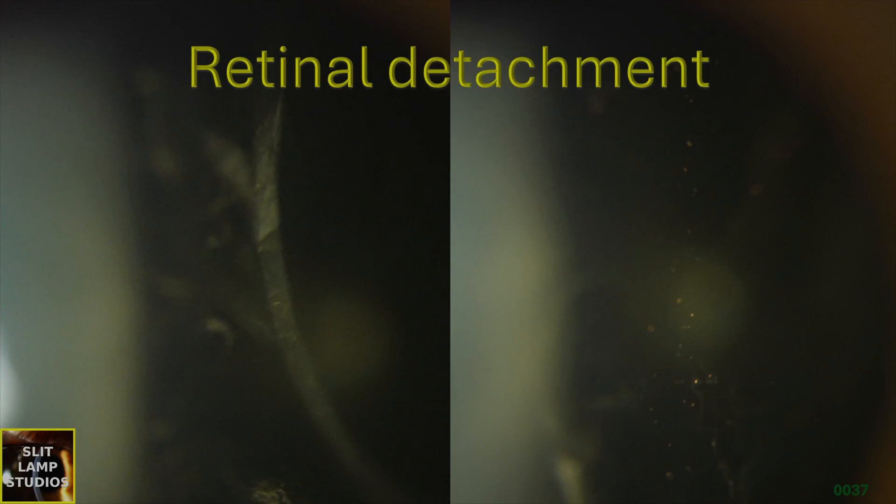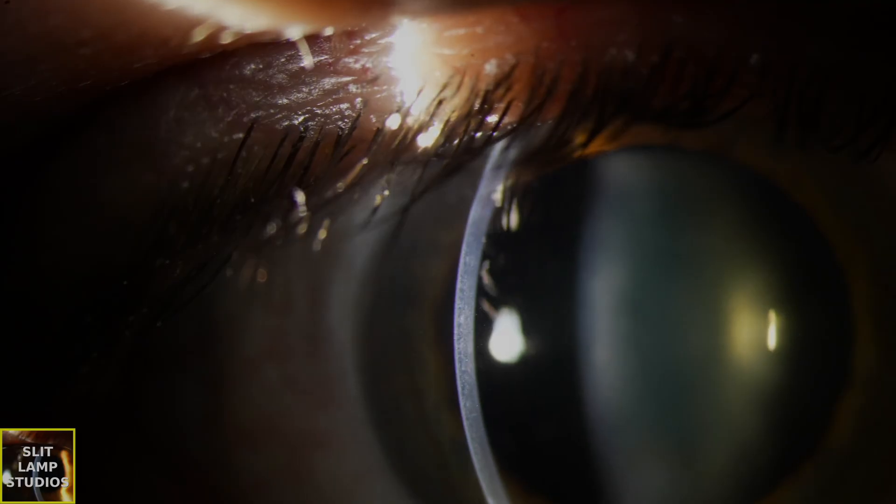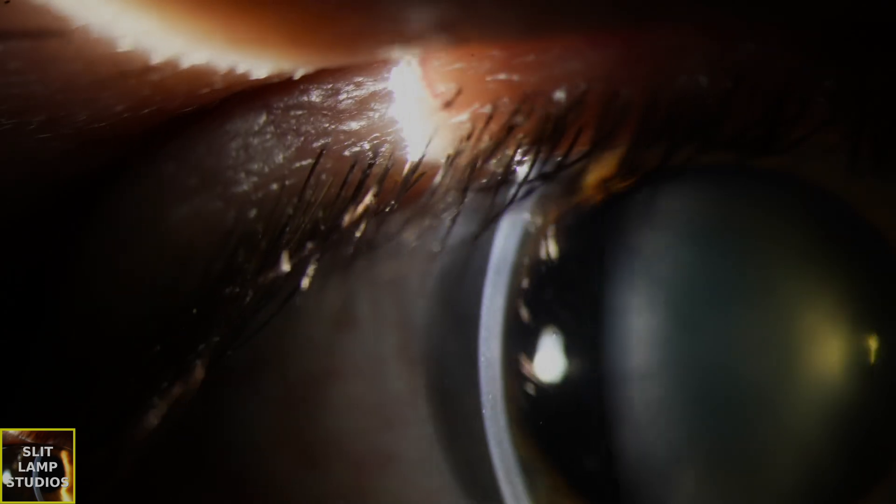Retinal detachment. In this case, we have a patient who presented with a two-day history of flashing lights and floaters. Let's have a look at the case and see what signs we can see.